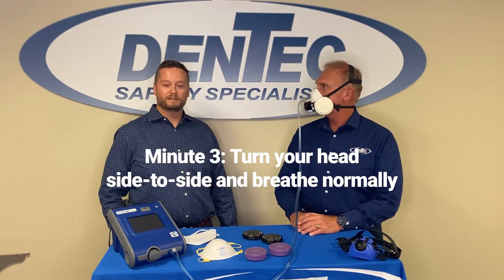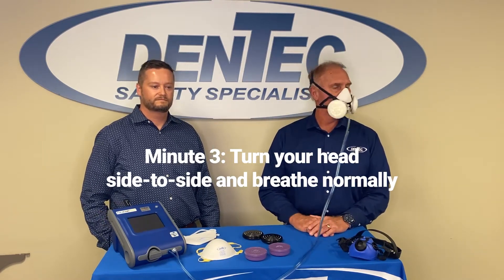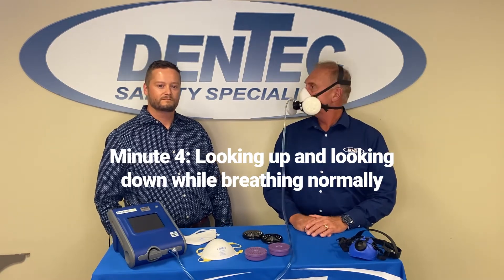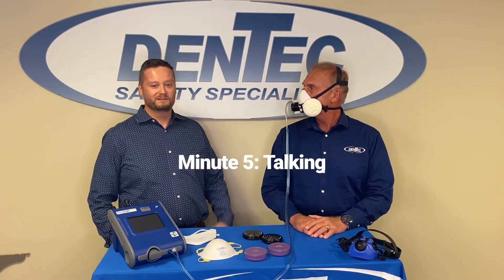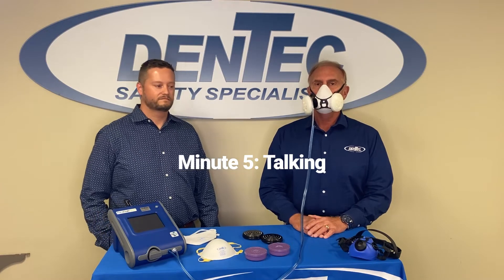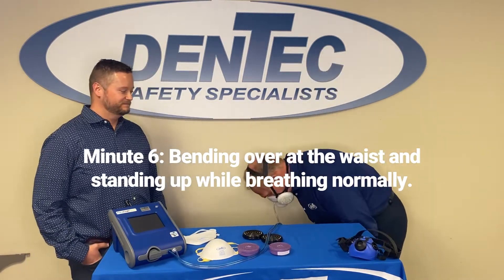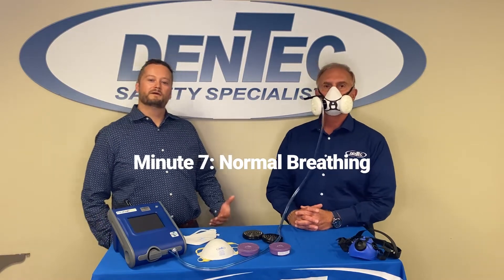Minute three will be turning your head from side to side and breathing normally the entire time. Minute four is looking up and looking down, again while breathing normally. Minute five is actually talking — we're all familiar with the rainbow passage, that's a common one, but you do want to have a minute of talking. Minute six is bending over at the waist and standing up again, breathing normally. And then last but not least, another minute of normal breathing.